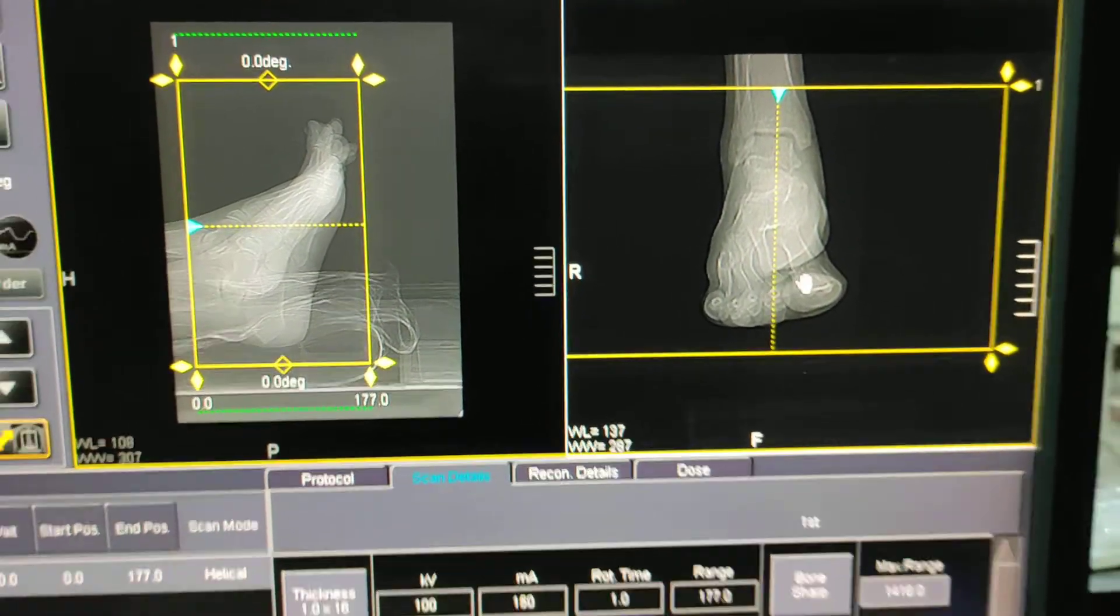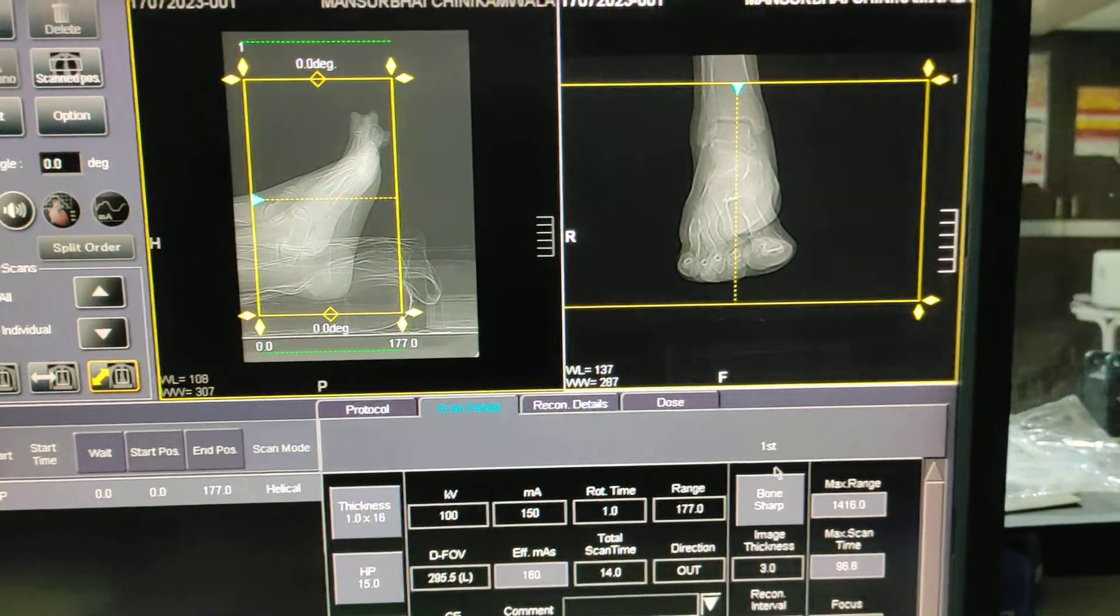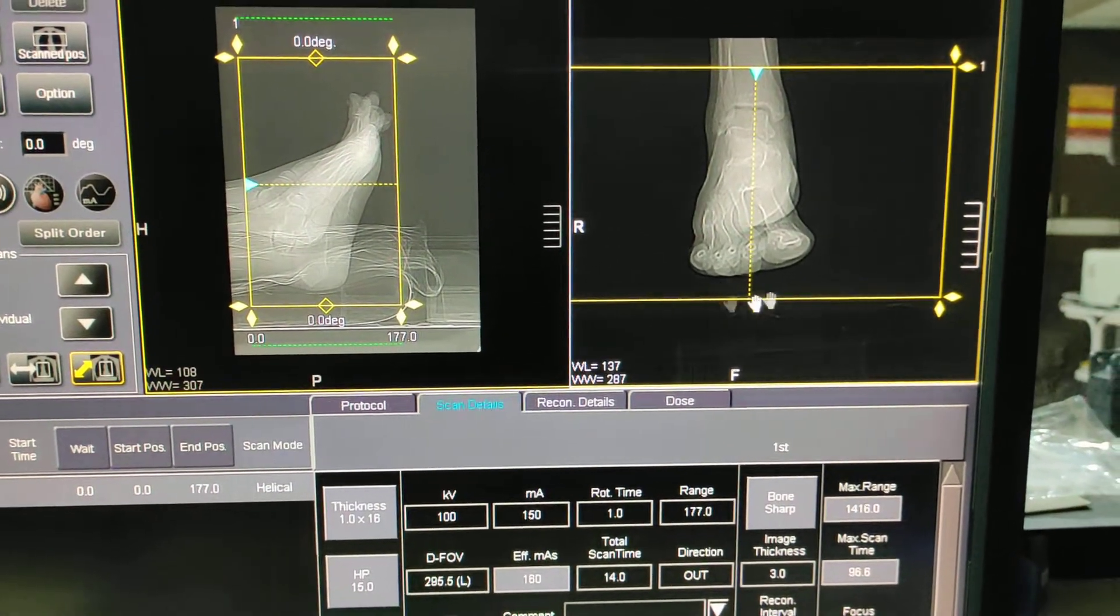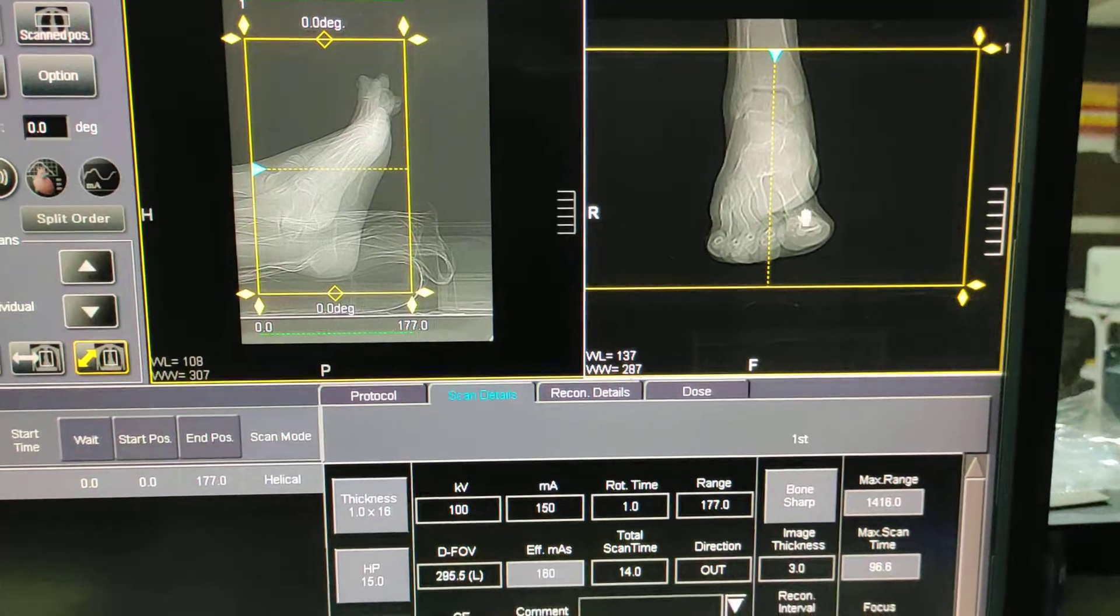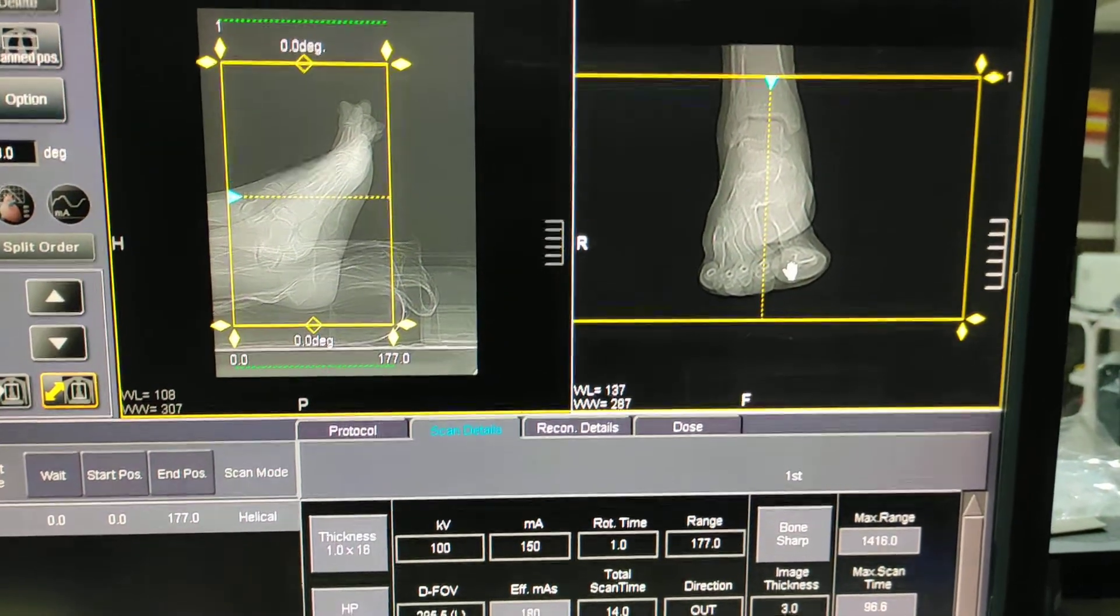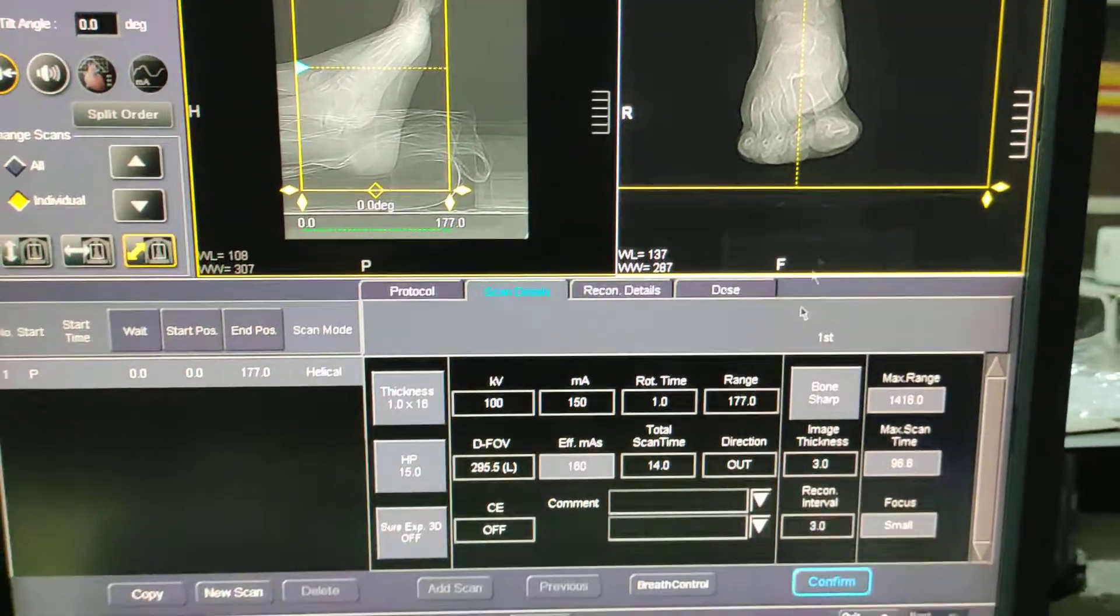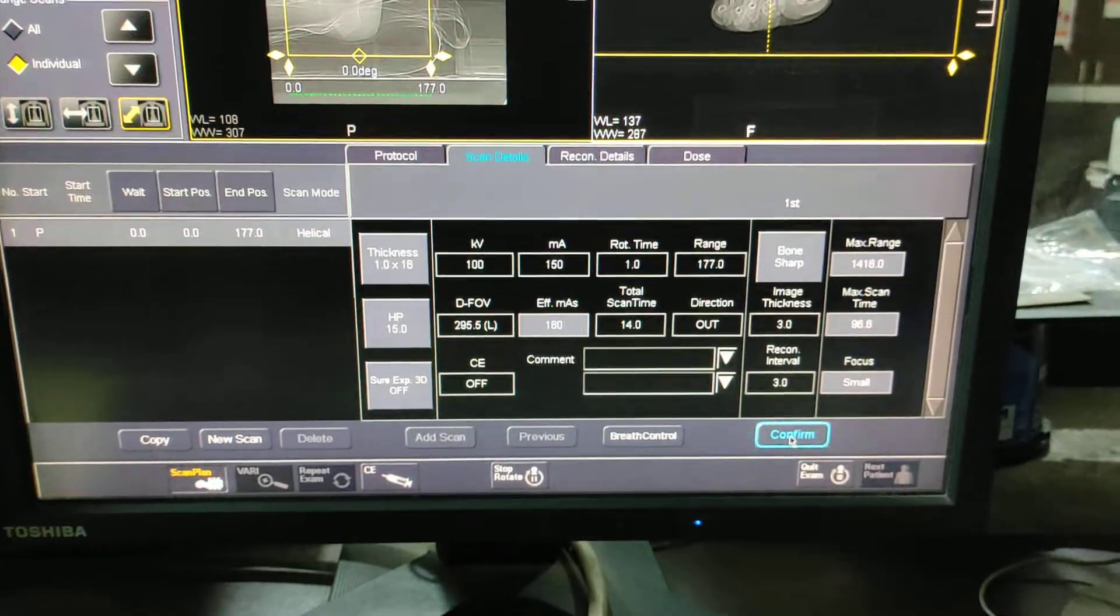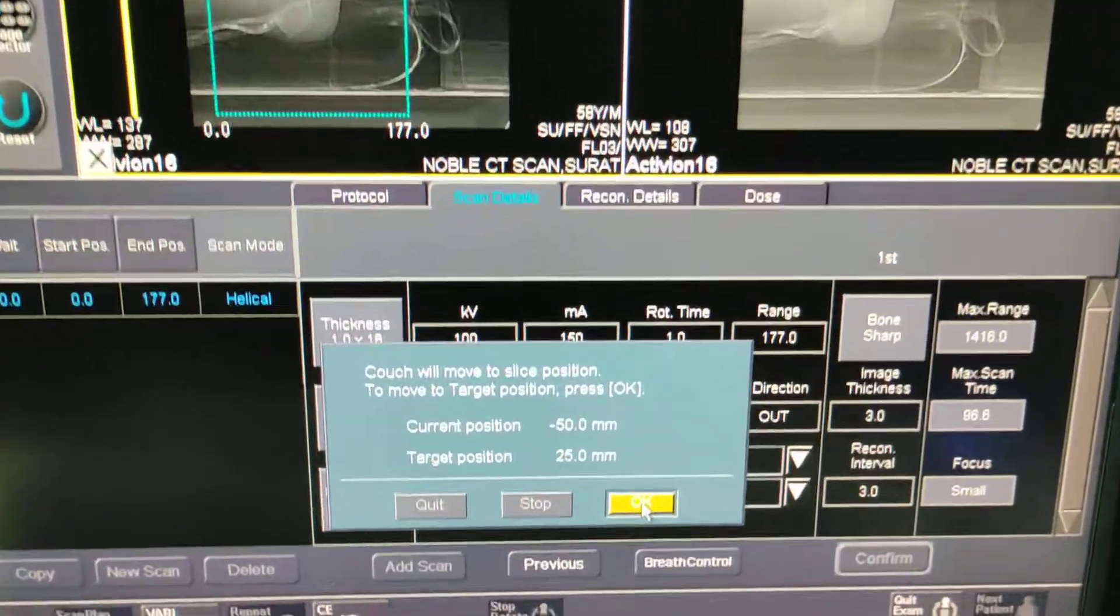This is the plan for ankle joint or foot. This is specially for foot. Here we are diagnosing the great toe osteomyelitis, so this is the plan. You have to start from confirm.